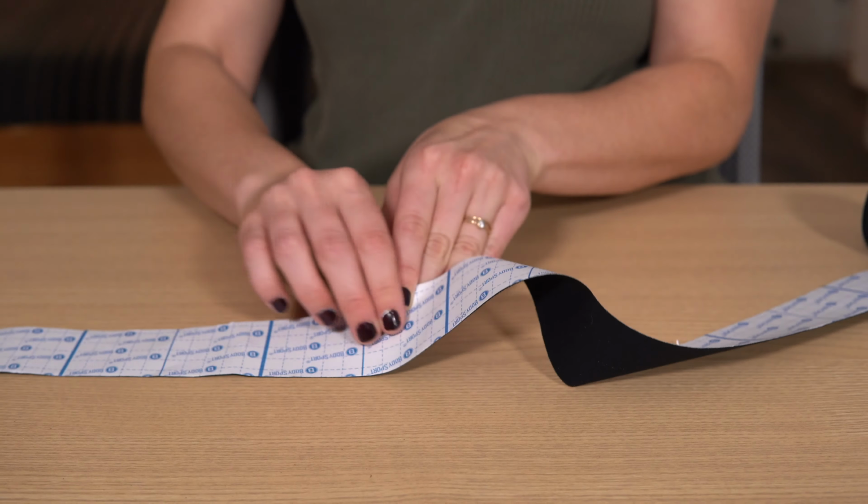So once you have both corners rounded, you're ready to start thinking about the actual application. So you're going to go about half an inch, quarter of an inch in and fold down the tape, and you're just going to rip the paper up. It's not going to rip the actual tape, just the paper, as you'll see here. And you're going to do that on both sides. We are creating our anchoring points here, which is going to allow us to put down the tape and start the tape application.